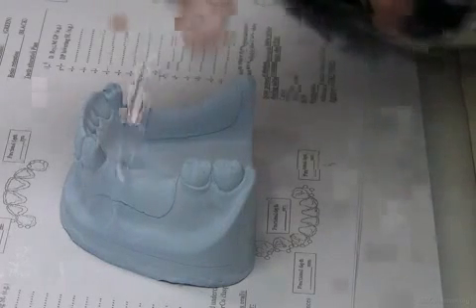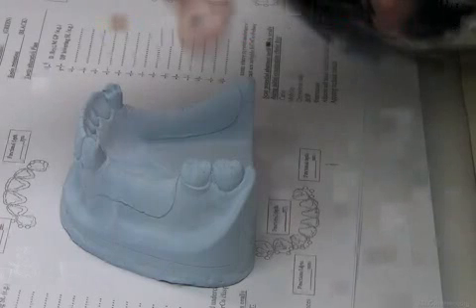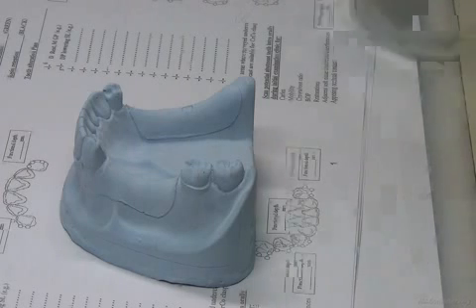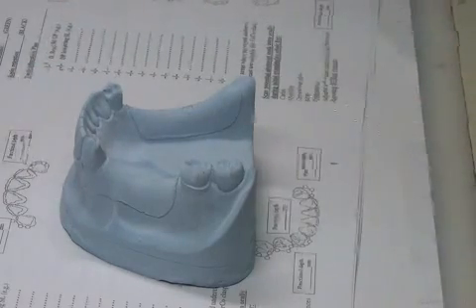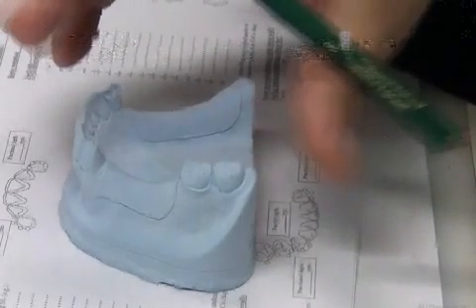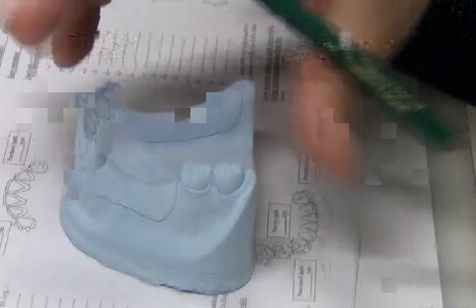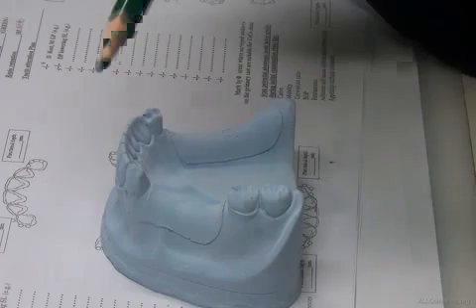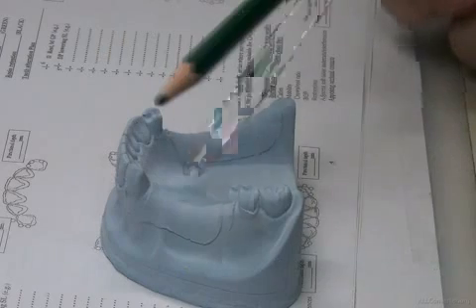Okay. What did we put in the bounded saddle area? Either lattice or mesh. In the case we gave you, we changed it to a mesh just for learning purposes, not based on occlusal analysis inside the patient's mouth. For educational purposes, we made you deal with an open lattice to see it and really feel it and look at it and really understand how thick it is. On the other side, you use the mesh, and now you know what a mesh actually is. So we changed this design here just for educational purposes.